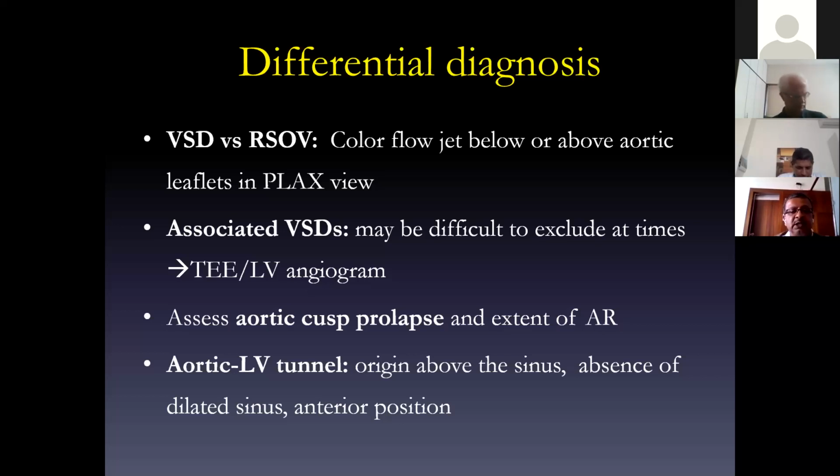The tunnel is another differential diagnosis. The aortic LV tunnel here is not very difficult. The origin is above the sinus, and the absence of the dilated coronary sinus and anterior position. This is not extremely difficult once again. That is why understanding the anatomy is extremely important.